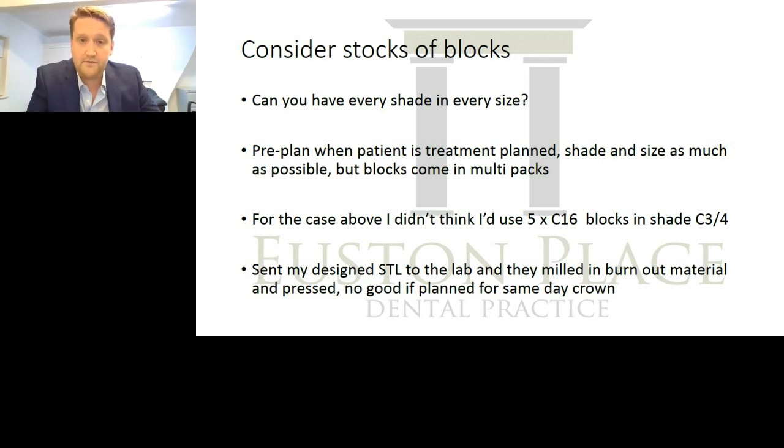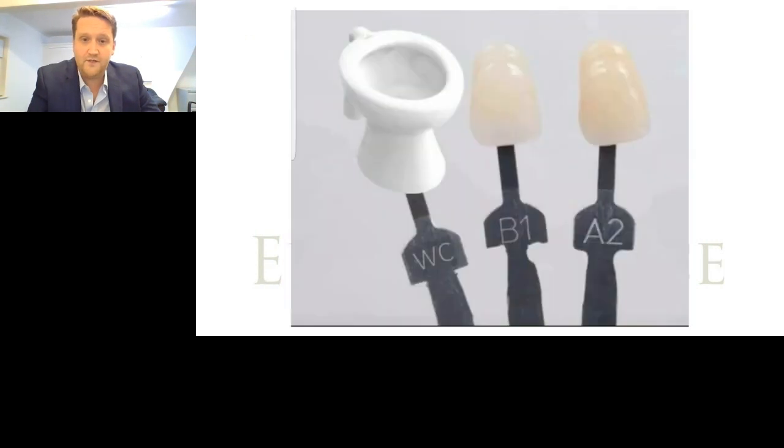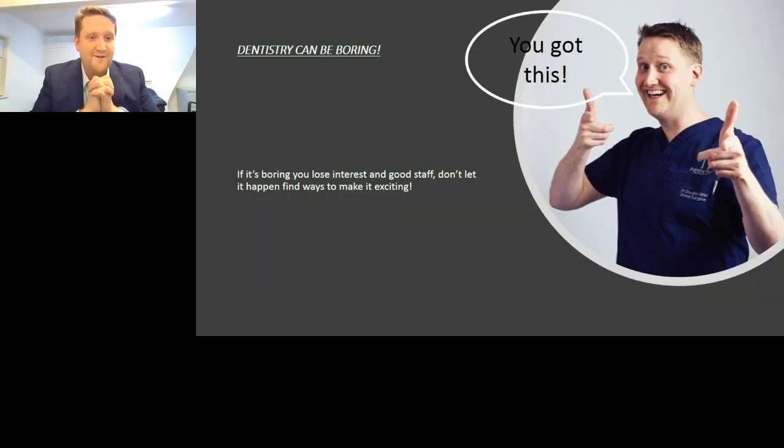Shades, obviously we've got lots of shades there, including a toilet shade. Some patients will want that, but again, might be one to send to the lab. So that's all I've got to say. Just try out the Trios if you're not using one. Get one of your reps to bring it in and let you try it if they'll allow it, and test it out. And it's great fun.